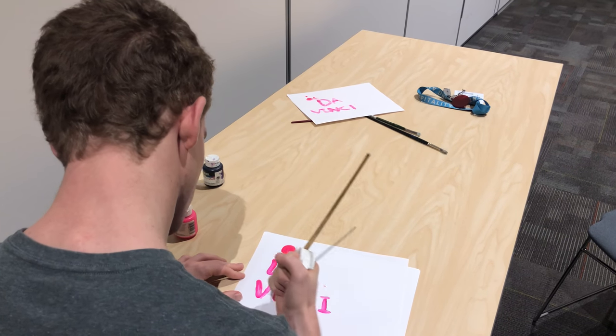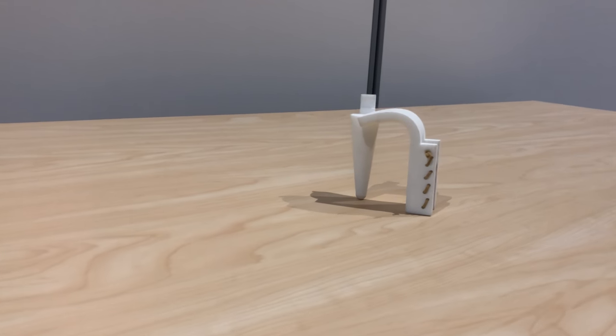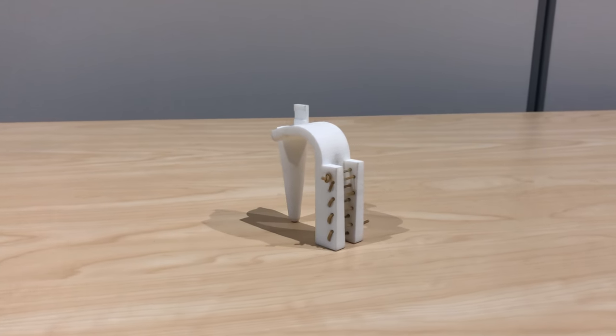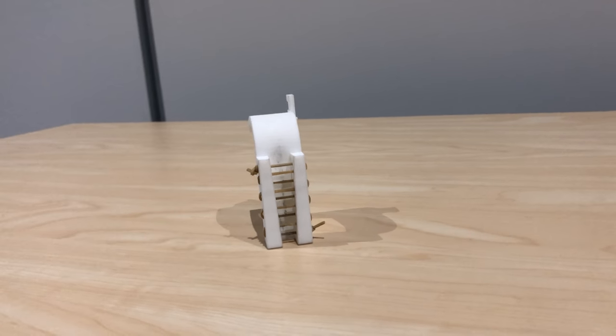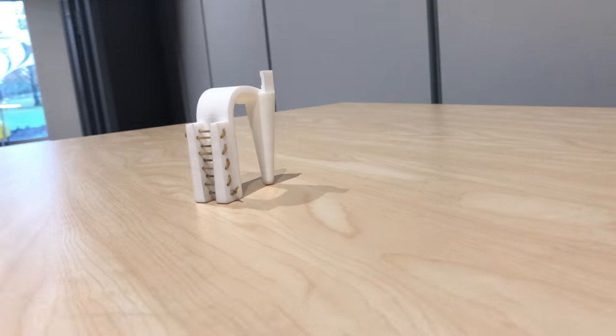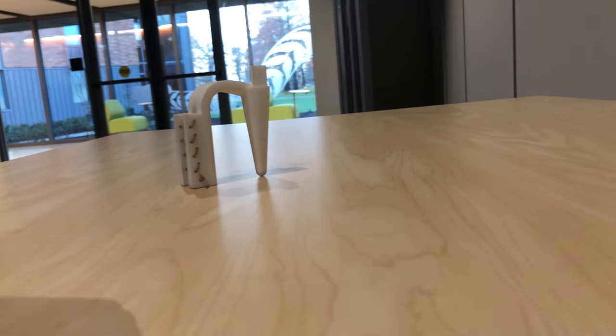With the help of a 3D printer, we've designed a device which will allow Ken, and others like him, to be able to use a paintbrush. The DaVinci is focused on intuitive processes that the user is likely already familiar with. It focuses on Ken's strengths, such as his ability to use his teeth to perform actions. The DaVinci has three central features that make it both easy and intuitive to use.